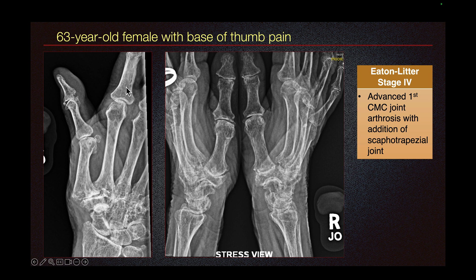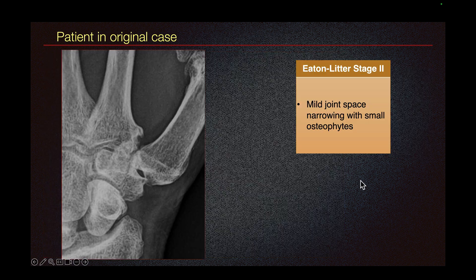Here we have a 63-year-old female with base of thumb pain. We can see the first carpometacarpal joint osteoarthritis, but also arthritis in the scaphotrapezial joint. In the stress view, we can see the arthritis of the scaphotrapezial joint and the first carpometacarpal joint on both sides. So this is stage 4 osteoarthritis.